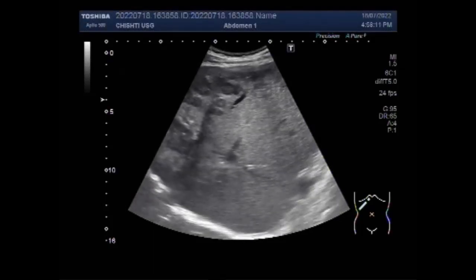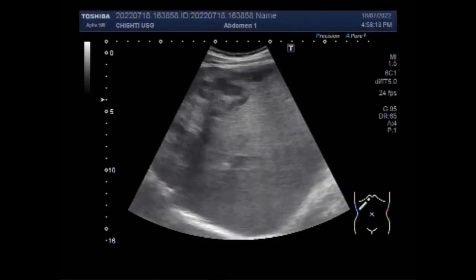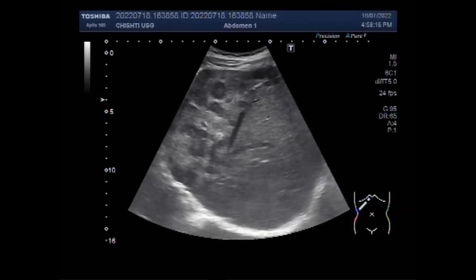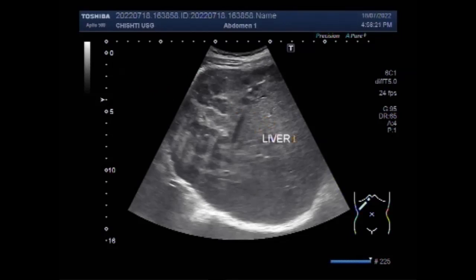Dear viewers, I hope you are all fine. This ultrasound video shows multiple hepatic metastasis. You can see the scanning of the liver and multiple metastasis are seen in the hepatic parenchyma, especially in the left lobe of the liver.